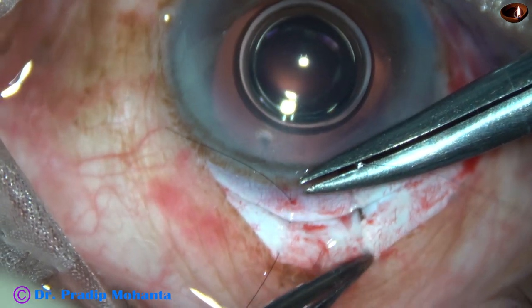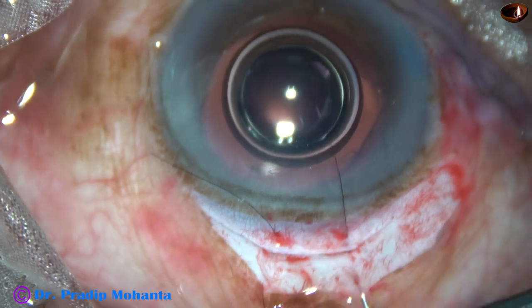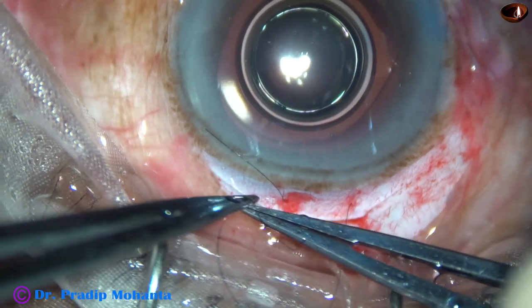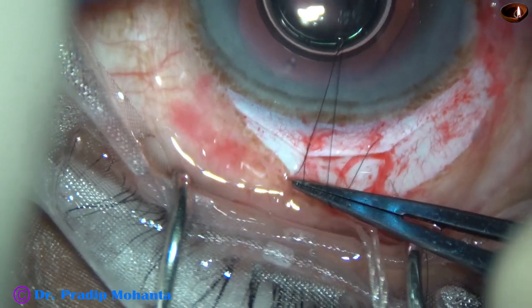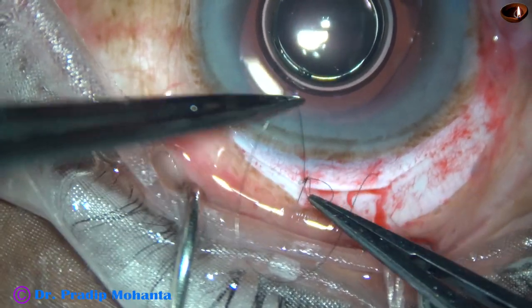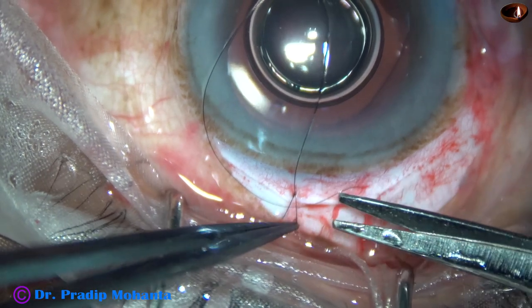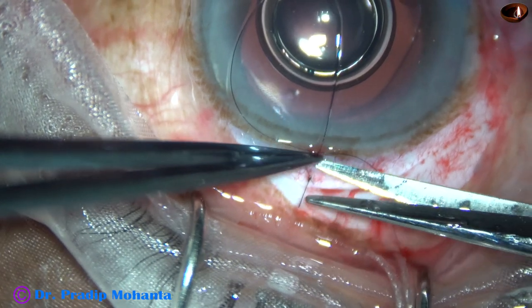I am going to follow up this case for about 48 hours and try to compare the astigmatism that has been induced or corrected — we will see that at the end of this video. This video is going to test your patience because it is going to be a long video of about 20 minutes. So this is one suture at the left end of the straight line. And now I trim the threads near the knot.